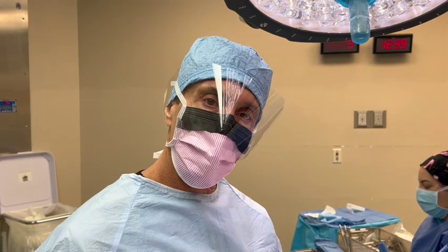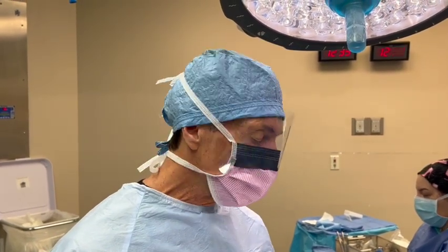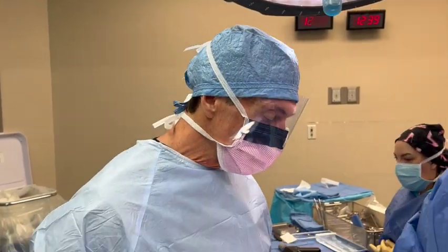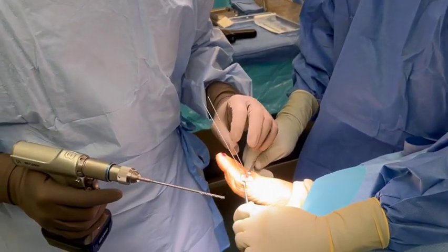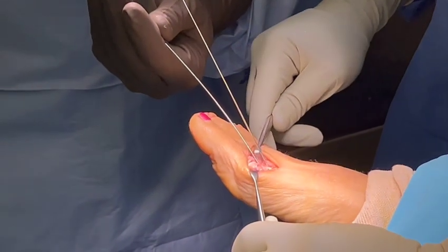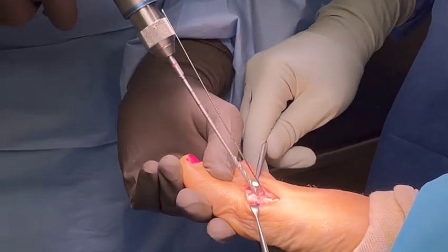This one, especially the Austin Bunionectomies, they do a little bit better with compression. So they have a 3.5 compression screw also made of the natural bone product. Down here, as you can see, I have a stabilized wire here, and this wire is actually where the screw is going to go. The center is cannulated, and it's made to follow this wire.